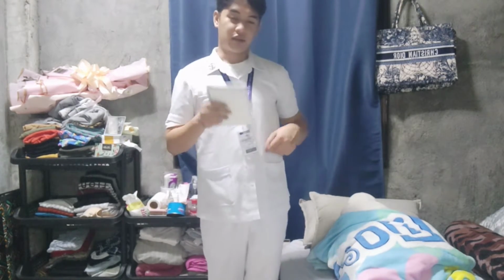Good day. My name is Christopher Denaque, and today I'm going to give a return demonstration of the intradermal injection of the parenteral drug administration. First, we need to check the doctor's order. The card of the patient is more reliable than the medication ticket. So I'm checking the doctor's order.